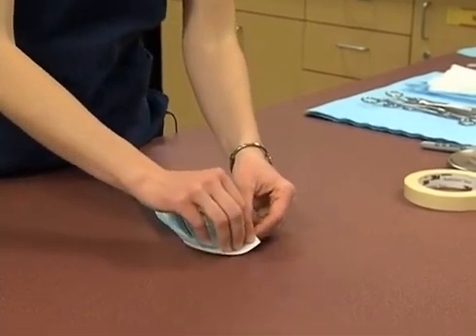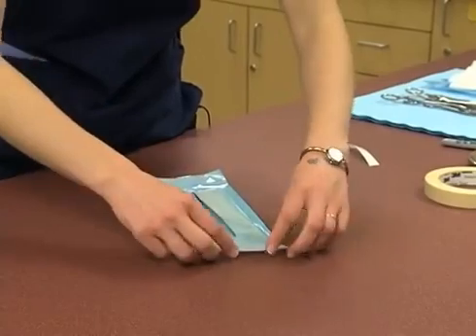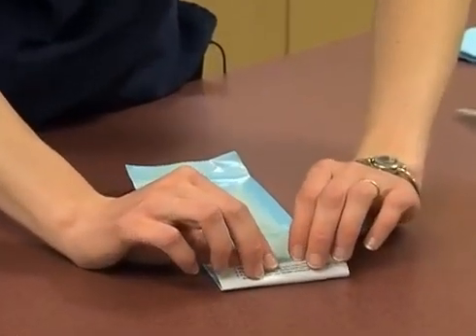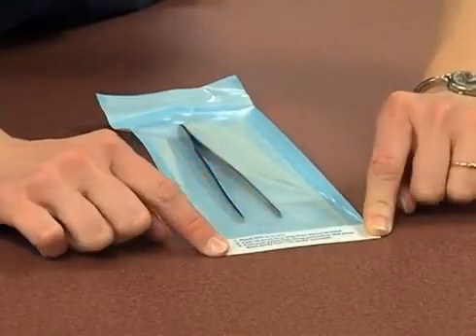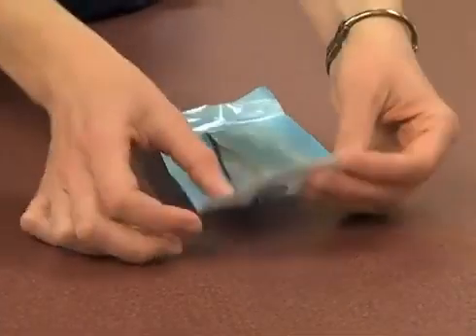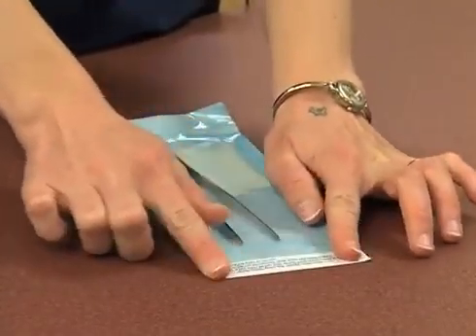The next thing we're going to do is just pull off that cover on the tape and then fold it over. One of the things with these pouches is that they must be folded exactly on this line. That means that it's been properly sealed.